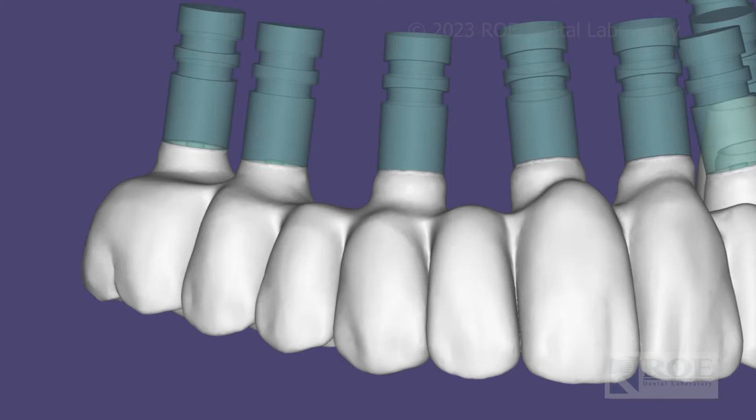But we do know that photogrammetry capture is very accurate, and it doesn't have the variables of the normal process: stone, PVS, Duralay, shrinkage, humidity, people, right? It removes almost all those issues, where you're stacking all the variables to make inaccuracies. You're going right from multi-unit into a virtual world. So we know photogrammetry at least eliminates a lot of the errors for that reason.